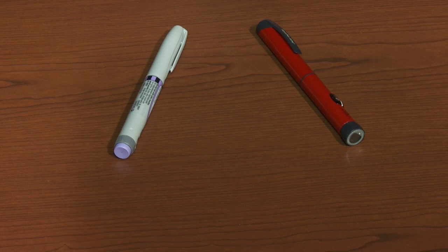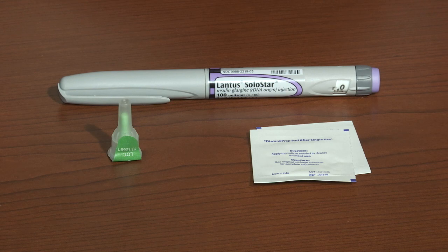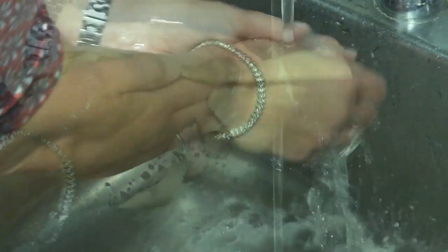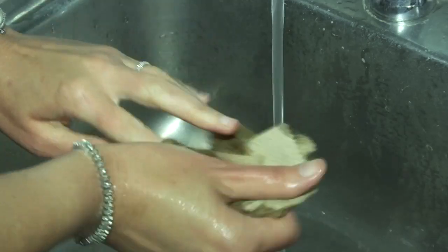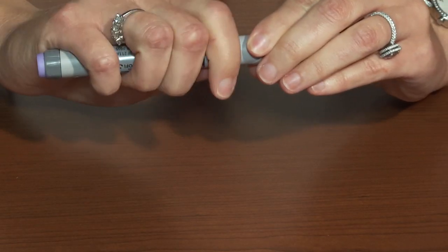First, gather your supplies, which include an insulin pen, an alcohol swab, and a pen needle. Begin by washing and drying your hands. Make sure you have the correct insulin pen, then remove the pen cap and set it aside.